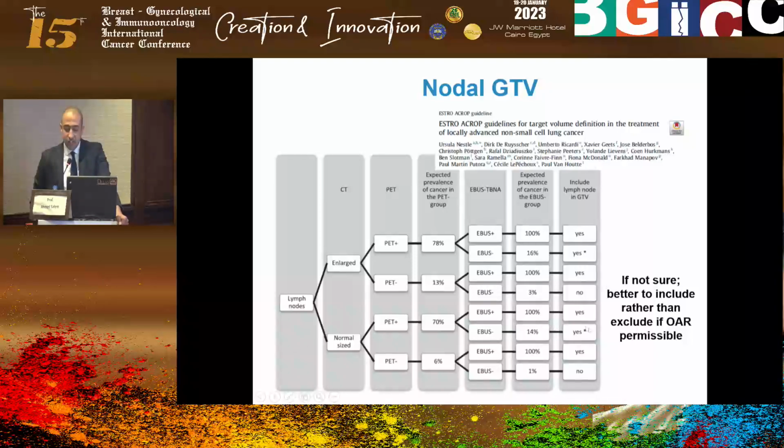In these cases, according to ESTRO-ACROP guidelines, we tend to include these nodes. You always tend to err on the side of caution if you are a little bit unsure. So this is what I can tell you.